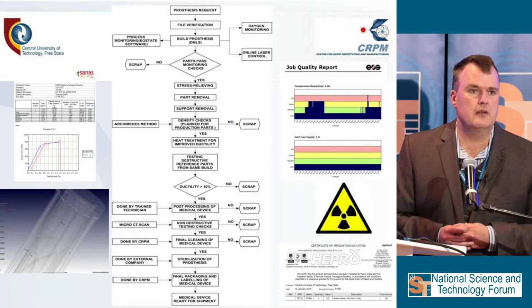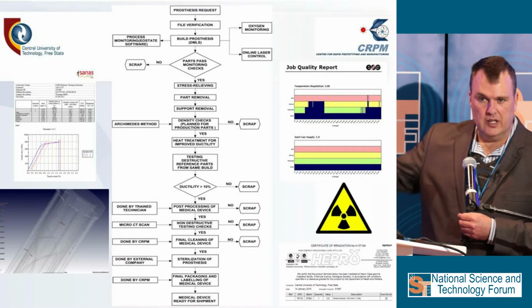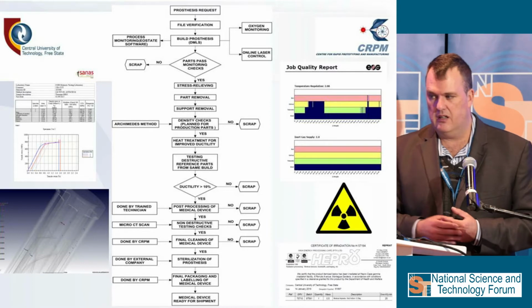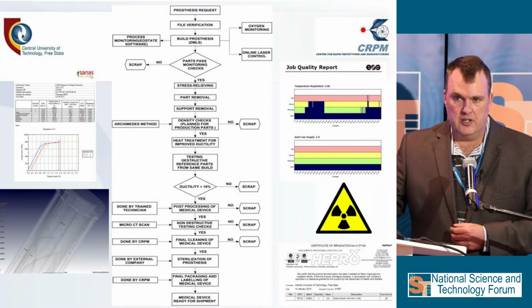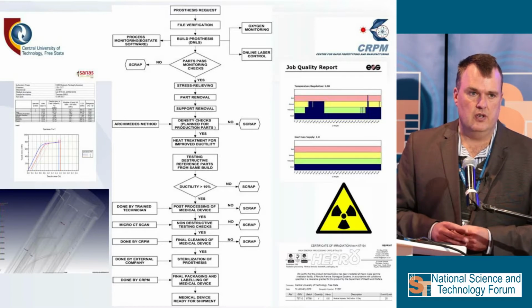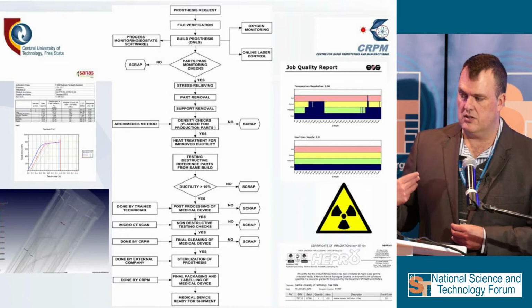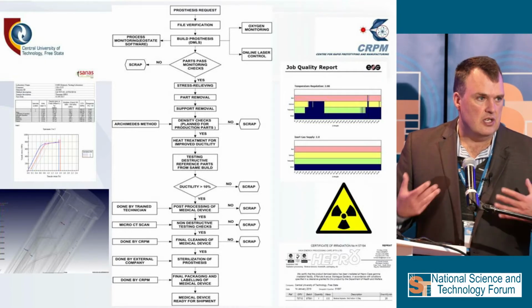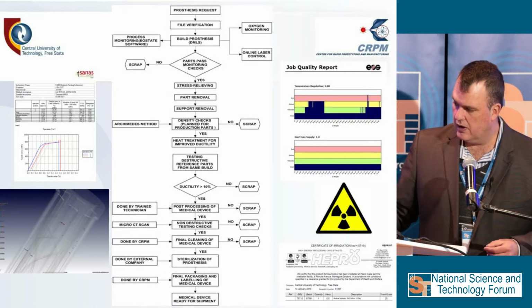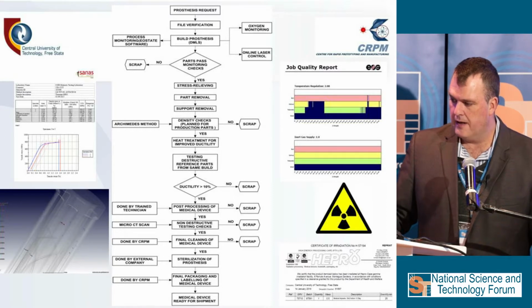Just to show you quickly, this is how the process looks that we go through, from where we design, get the prosthesis request, the monitoring. I will play you now a last video about this process monitoring and how the machine manufacturers look at this and how they can generate in-process monitoring while the process is running. So this is the video, and then I will end off.